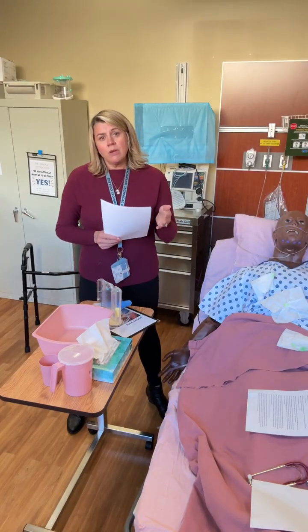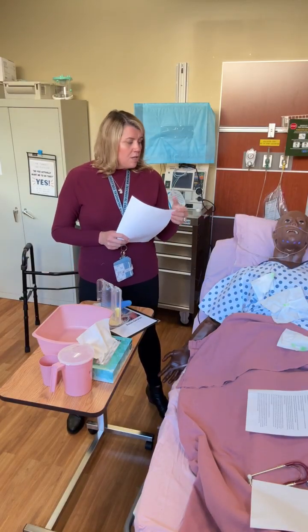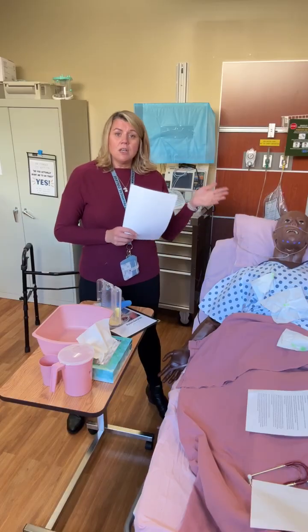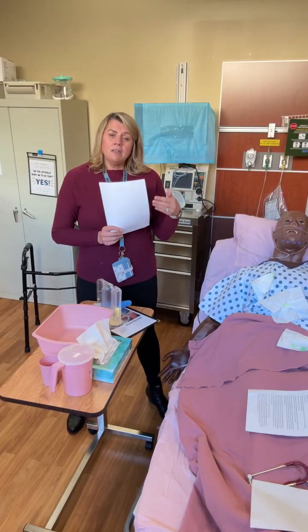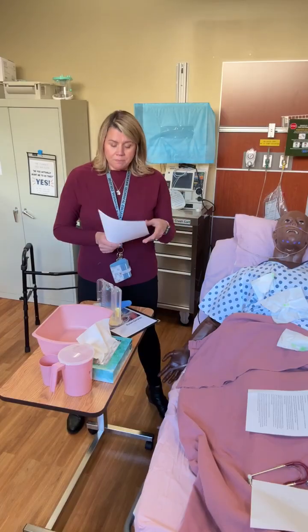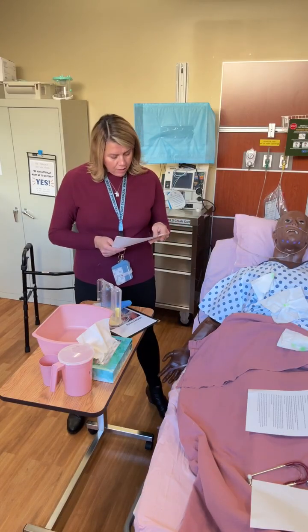Typically for Stan, we are going to do a med nurse and an assessment nurse. And your assessment nurse is exactly what that is: you're assessing the patient, you're assessing what he's telling you, and then you're going to do treatments and interventions. The med nurse is going to take that information, that data, and determine the critical assessments and find out if the medications are indicated or due, and then give them. The med nurse will document on the MAR, the assessment nurse will document on the treatment form, or the TAR.